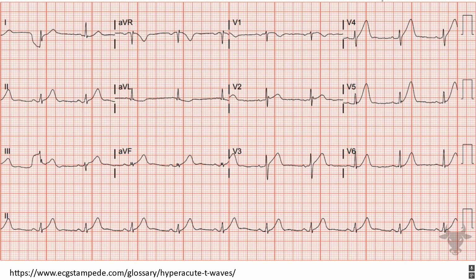Axis, two thumbs up. Your left thumb is I, your right thumb is aVF. Left thumb up, left axis, right thumb up, right axis. Two thumbs up, normal. Two thumbs down, abnormal. For intervals, we're worried about the QTc and the QRS. You can use the machine in real life, but the QRS should not be over three boxes, and the QTc should not fall halfway between each R wave.